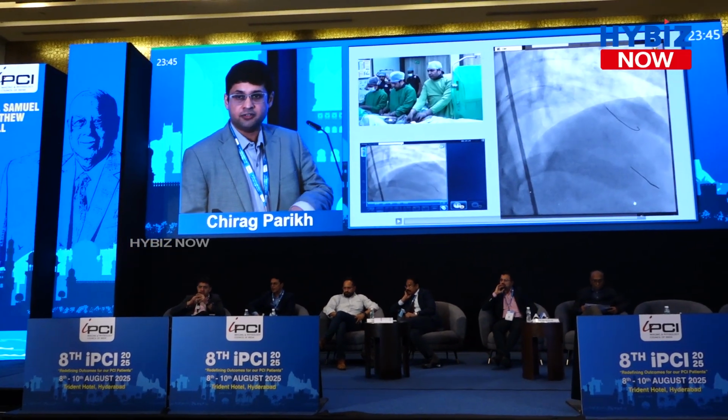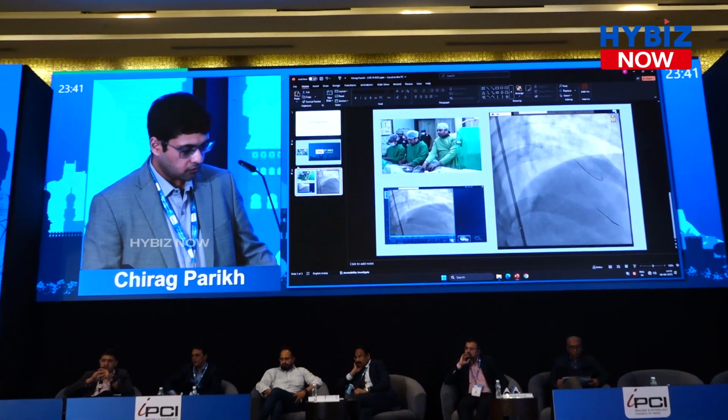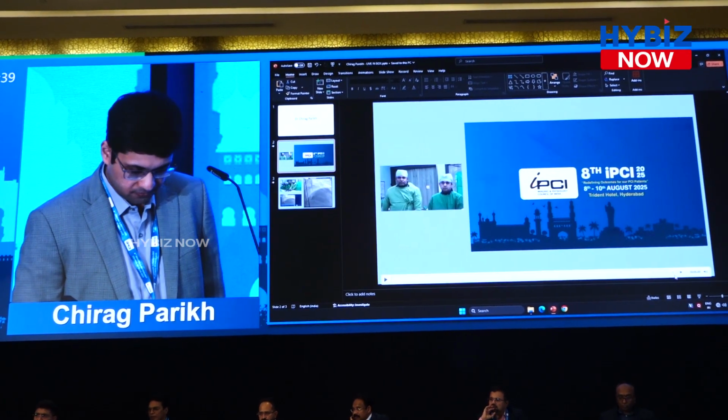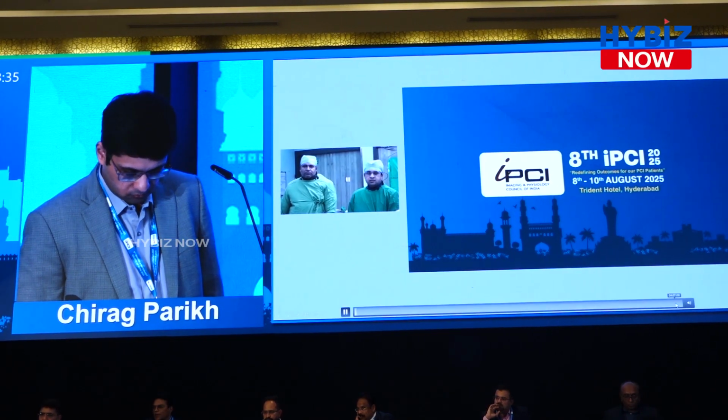The syncretion system works best with, go back to the old video, please. Now let me control it from here, please. The syncretion system, I'll control it from here.